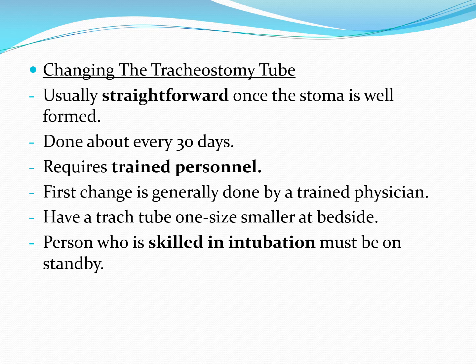It requires trained personnel. First change: once the tube is put in place, roughly 30 days later, they should have a trach tube change. Generally it should be done by a trained physician. Many hospitals say the first one really should be done that way because the stoma has now formed around the tube, and some of that tissue may have attached to it, so it may require a very minor cutting, a minor surgical procedure, to get it out.